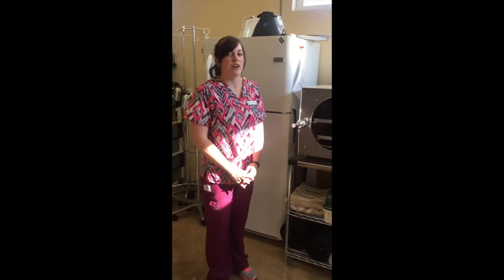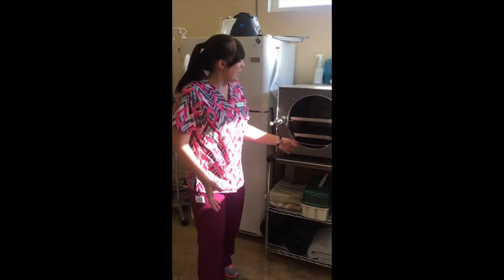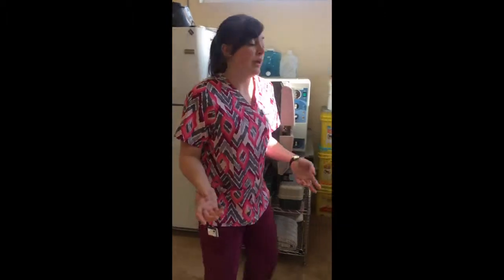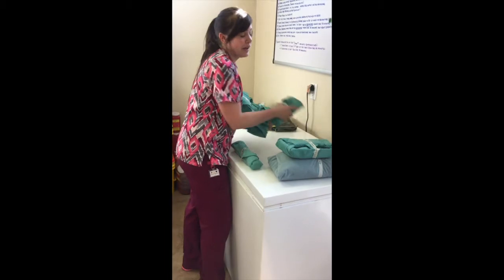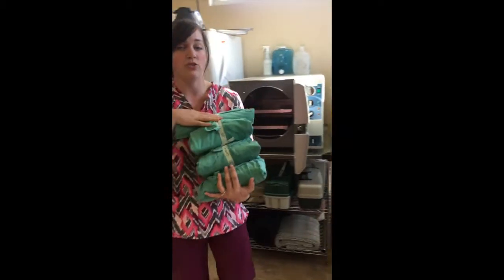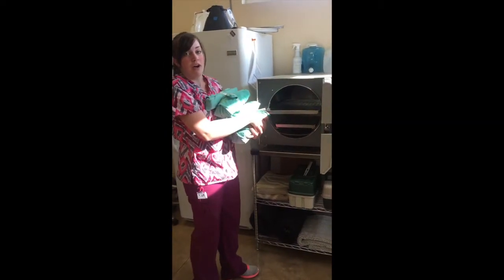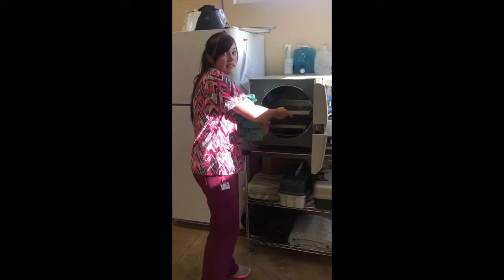Okay, now I'm going to be demonstrating how to properly pack an autoclave. So I have two different levels in our autoclave, so I'm going to show you the proper way to do that. So I have my packs here. When you're packing your autoclave, you want to make sure that there's enough spacing in between each pack. If the spacing is too little, there could be too much contact and the pressure won't get to the inside of the pack.